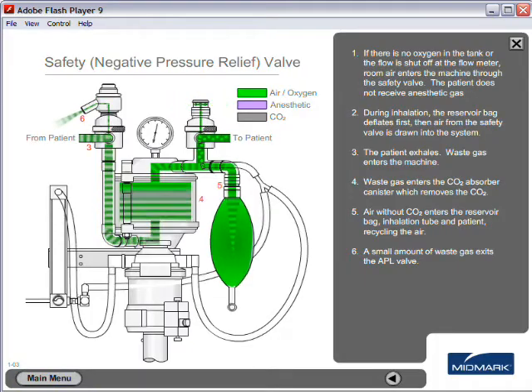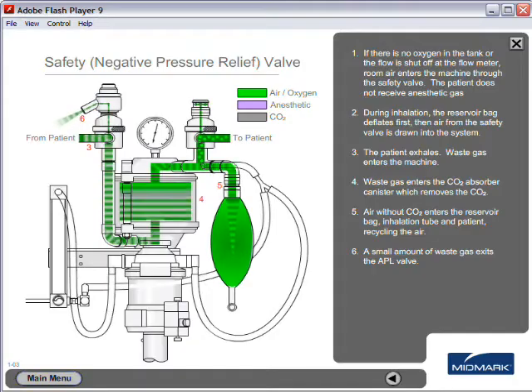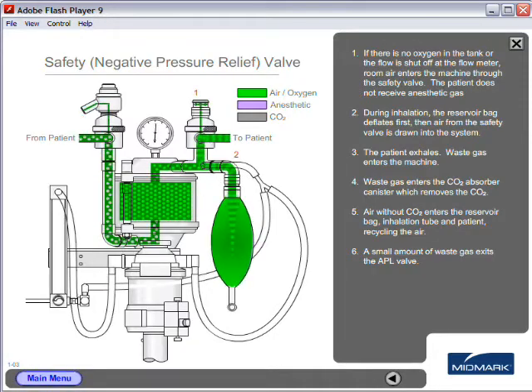During inhalation, the reservoir bag deflates first, then the air from the safety valve is drawn into the system.